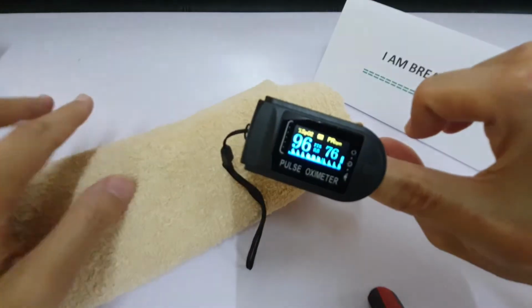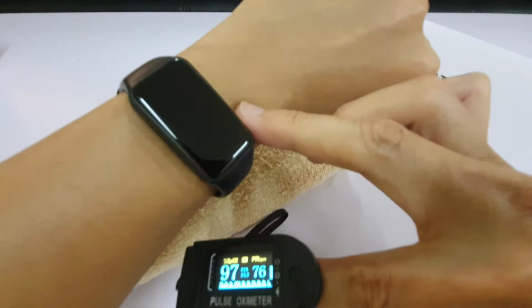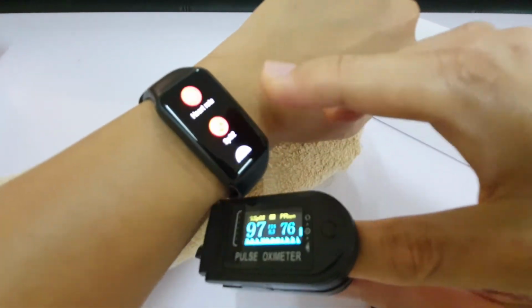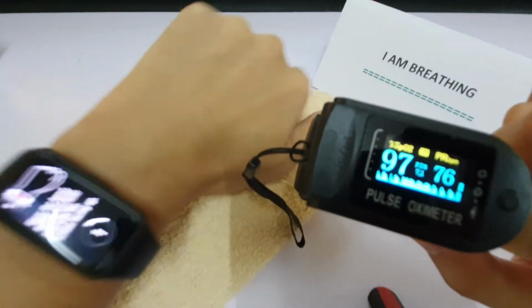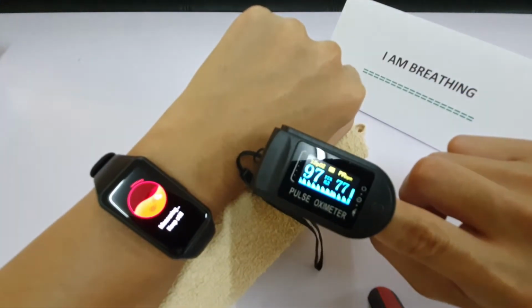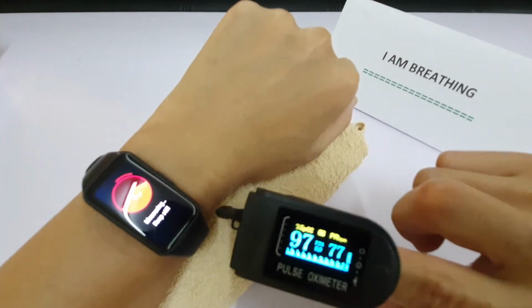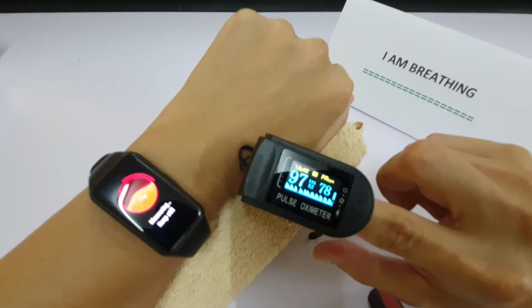Okay, let's get over to wide angle view. Right, so my fitness band, let's see if I get to SpO2. Okay, so let's measure that. I'm actually wearing the fitness band fairly tightly, as I should be.